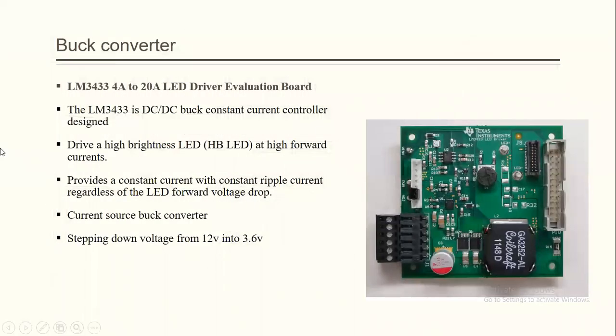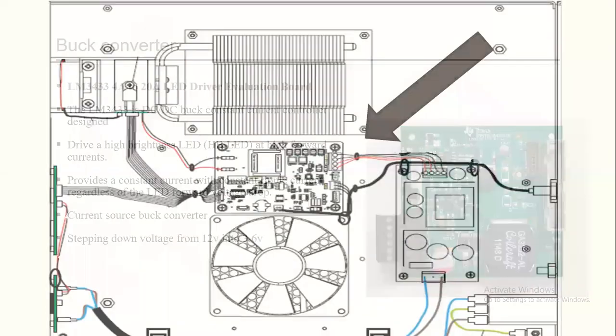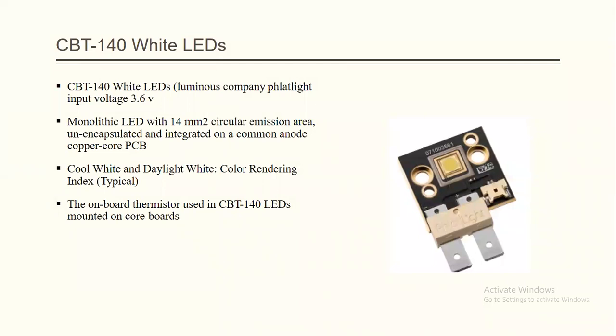So, that's why we go to the buck converter LM3433. It provides an ampere of 4 amperes to 20 amperes. It's from Texas Instruments. It will cost you about 200 bucks. And we can manipulate or we can set the output current, output illumination by two ways: by the potentiometer right here and by the PWM pin right here. It will provide 3.6 volts and of course the LED maximum power is 100 watts.